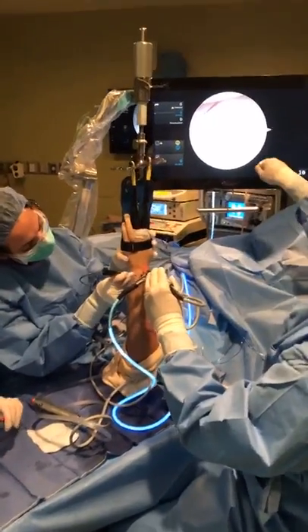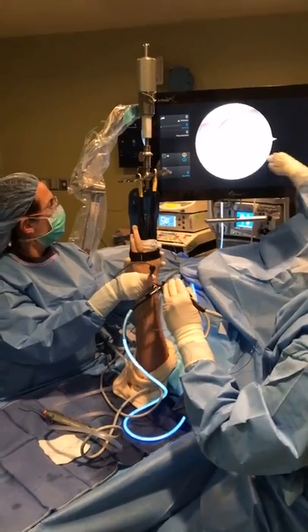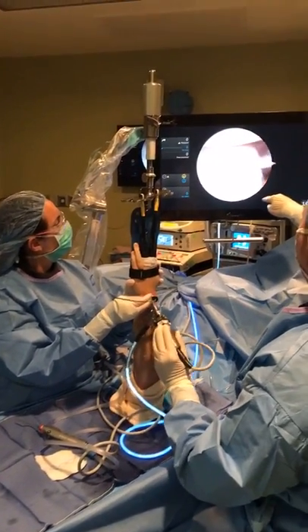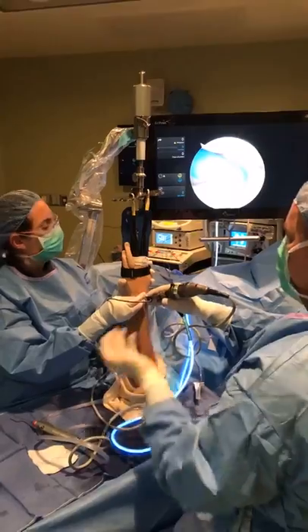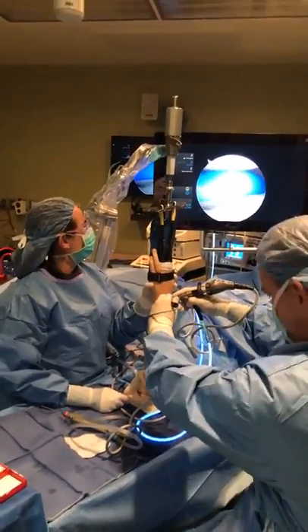Now when I see an acute fracture or a non-union, meaning a bone that didn't heal, you can see the fracture across here. But this is just absolutely perfect, right? And then I can look up here, and we can have some fun with the anatomy, but let's get to the job. Hey, Kate, thank you for doing that. Step ahead.